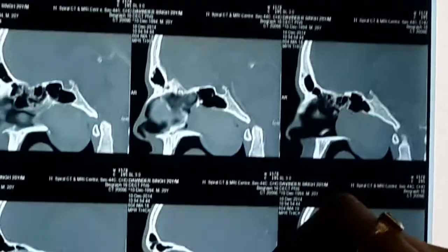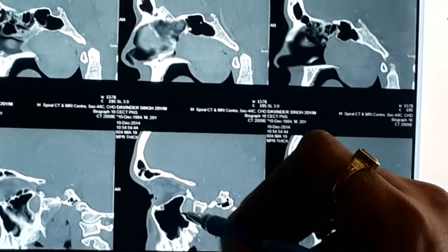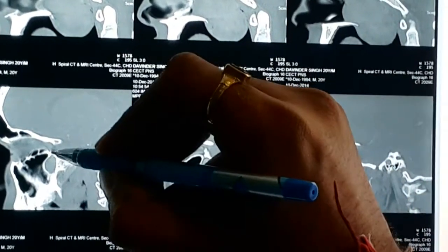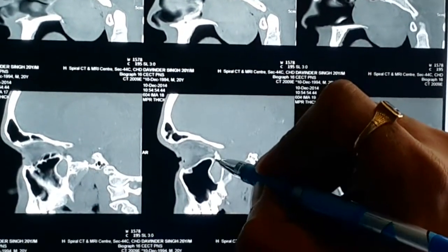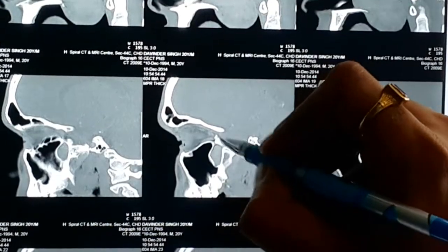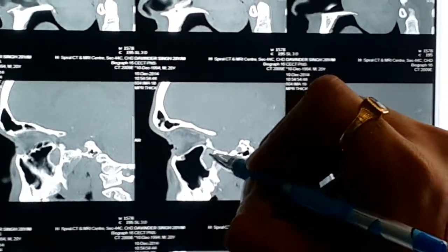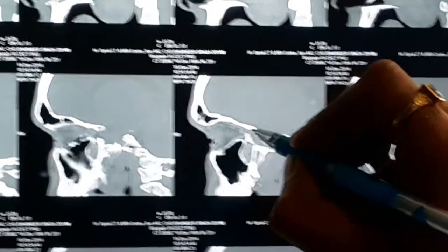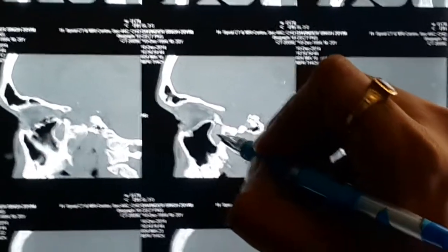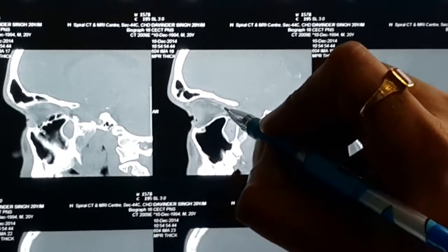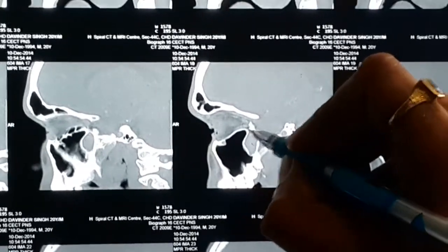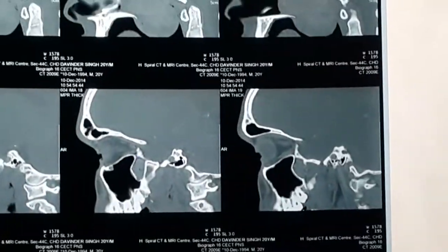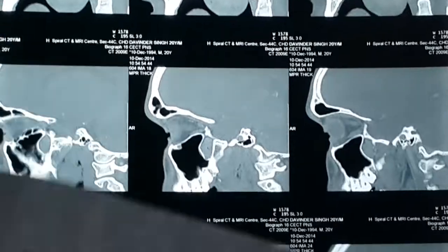Now see — this is the orbit. This is the tumor in the pterygopalatine fossa. This is the inferior orbital fissure — it's completely blocked by tumor. There is no tumor going into it; otherwise it would have been widened. Here is the tumor in the orbital apex. This is the orbit from anterior to posterior, this is the orbital apex, this is the pterygopalatine fossa, connected through the inferior orbital fissure into the orbital apex. So this is completely blocked. If it goes up, it only pushes — it doesn't erode. Everywhere it goes inside, it pushes; it never invades.